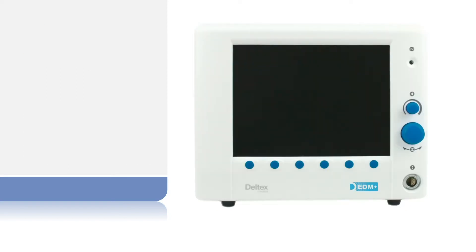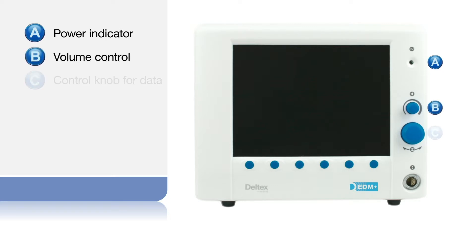On the front of the monitor are a green light that illuminates when the power is on, a small volume control knob, and a large control knob which rotates to change and select parameters such as age, and can be pressed to confirm a function. On some screens it can be used to select those functions appearing as a lighter color.